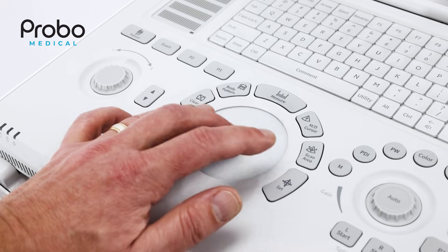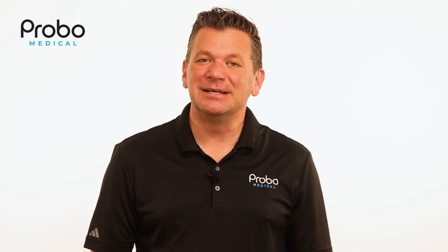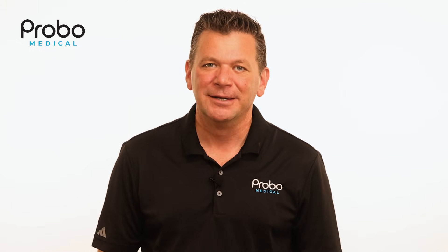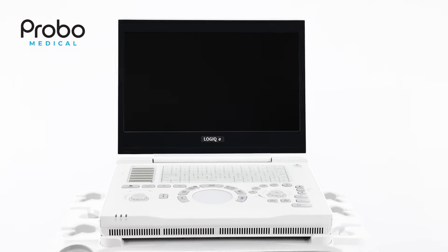About that trackpad — this one's a bit controversial. Some like it, others don't. Most sonographers will say 'ick,' but this machine isn't designed for sonographers who will be using this eight hours a day, five days a week. In nearly all those cases, a cart-based machine is a much better option. Sonosite has been doing the trackpad since the early 2000s, so this isn't revolutionary, and adapting to the trackpad doesn't take long.